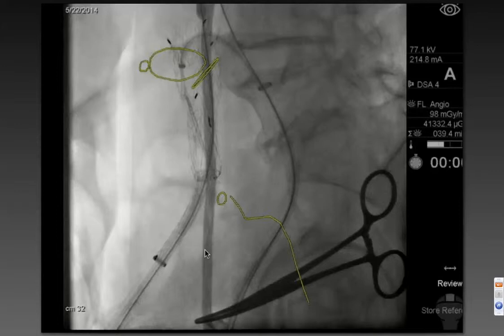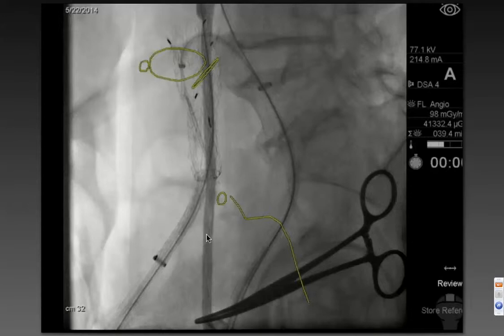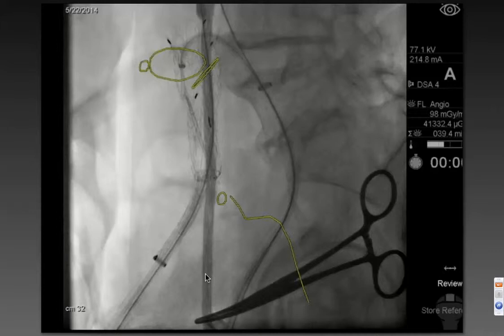This giant device that you see in the background here — our nursing staff and our anesthesia staff are always very apt at marking off what we actually need to catheterize, because there's always something on the patient that is exactly where we want to be working. This is a device that is on the patient that happens to show that we really need to go right through that contralateral limb and catheterize the gate. Always good to get a little help from our anesthesia colleagues when we're doing things like this.